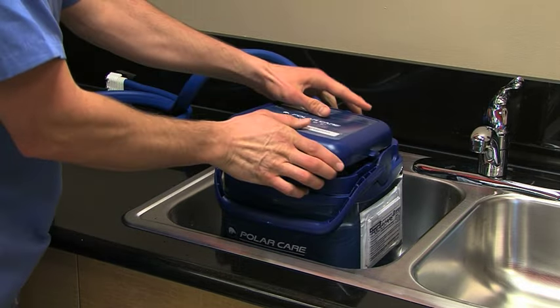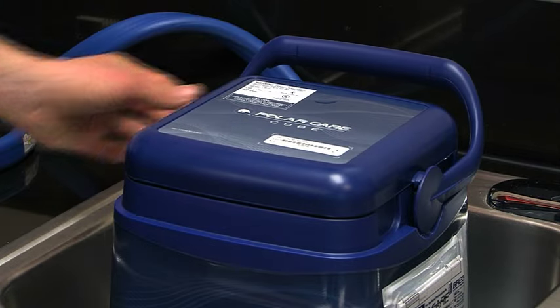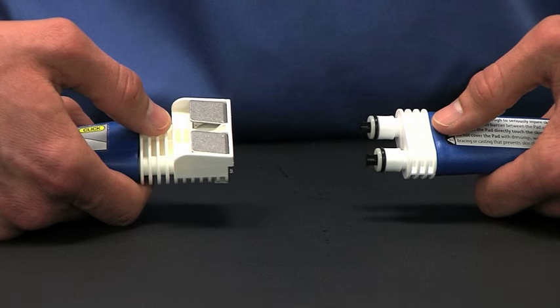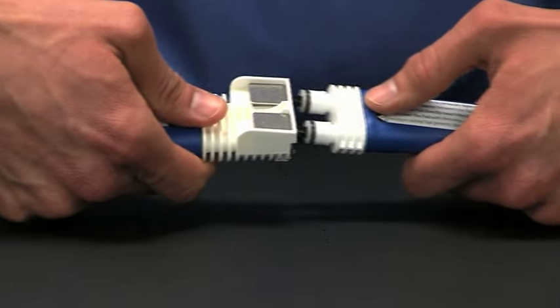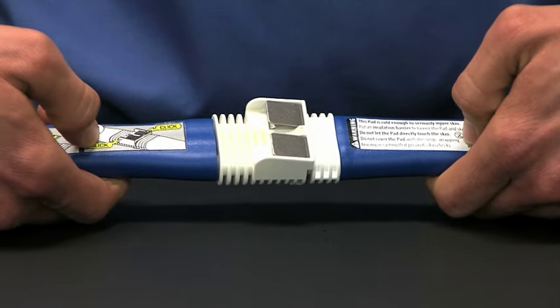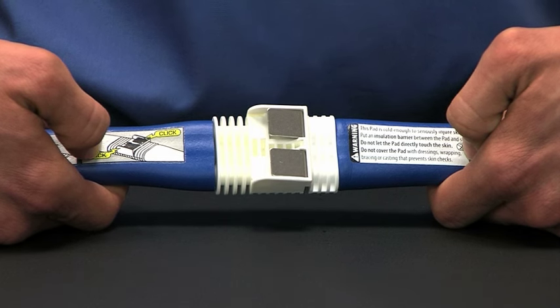Once filled, place the lid on the cube with the hose pointed away from the product descriptor and lock the lid into place with the handle. The next step is very important. Before connecting the pad to the unit, push down on the two metal tabs. You'll hear each click when you push them down. Firmly push the unit and the pad together. You will see the two metal tabs pop back up and hear the clicks. If you force the unit and the pad together without depressing the metal tabs first, you may damage the connector.